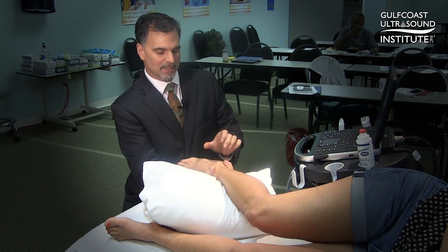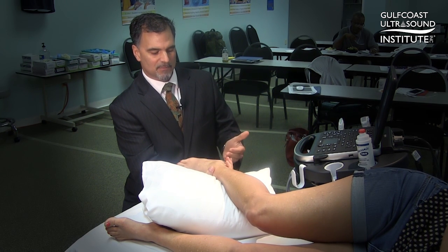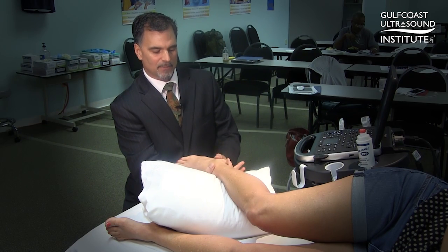Once we get the ultrasound on, we'll perform an anterolateral drawer stress test where we're trying to move the calcaneus anteriorly with a slight inversion.